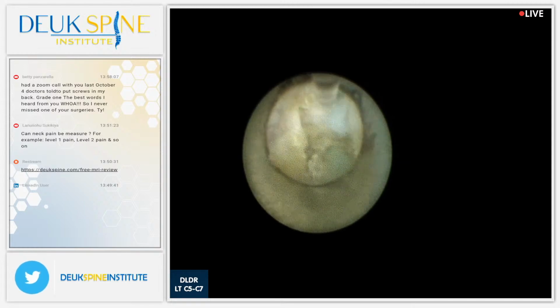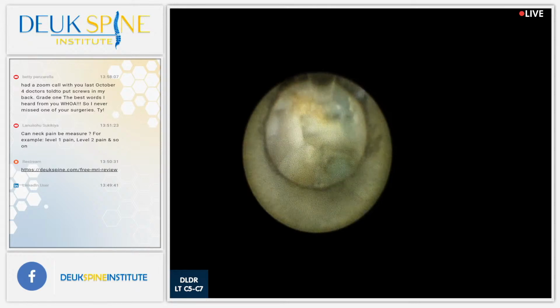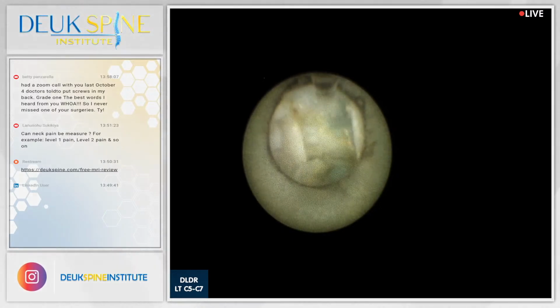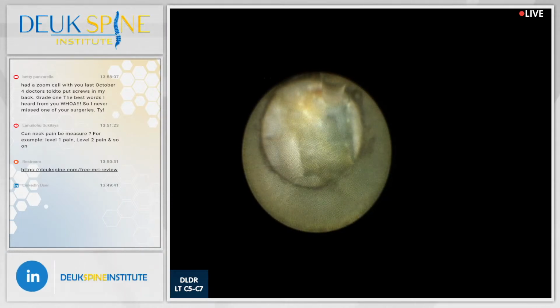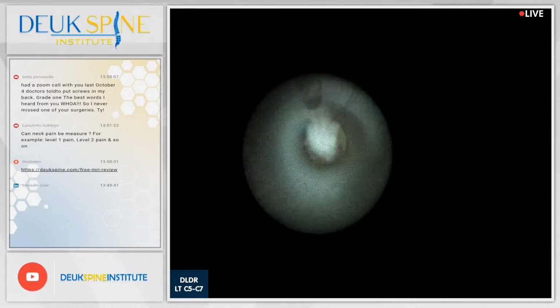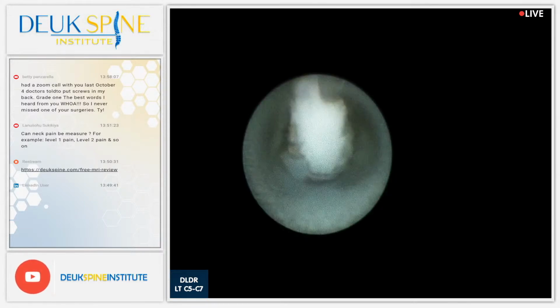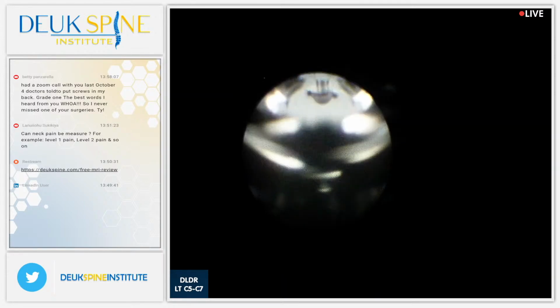Look at that piece right there. That's a piece of herniation. It almost has a waxy, blue candle appearance because it's got scar tissue in the herniation. The body has been attacking it with the inflammatory system, trying to get rid of it, but unsuccessful because your body cannot. There's another piece. Look at all those pieces of herniation coming out. Those are literally pushing on his nerves. That is the extruded herniation, Steve, right there. I literally just got rid of it, right? But there's probably more pieces, so that's not going to be all of it.